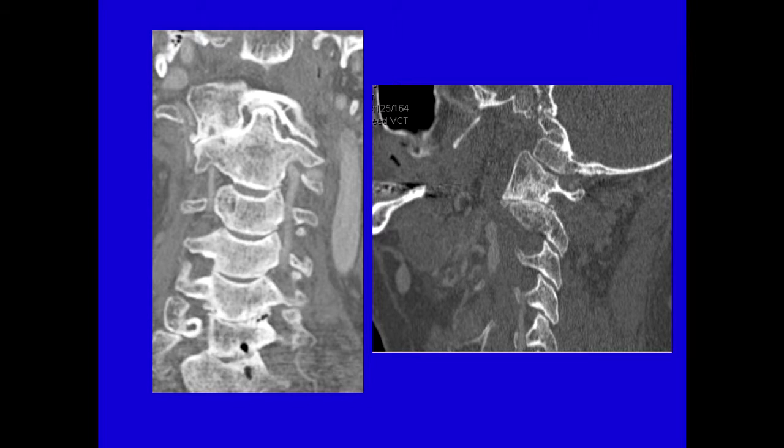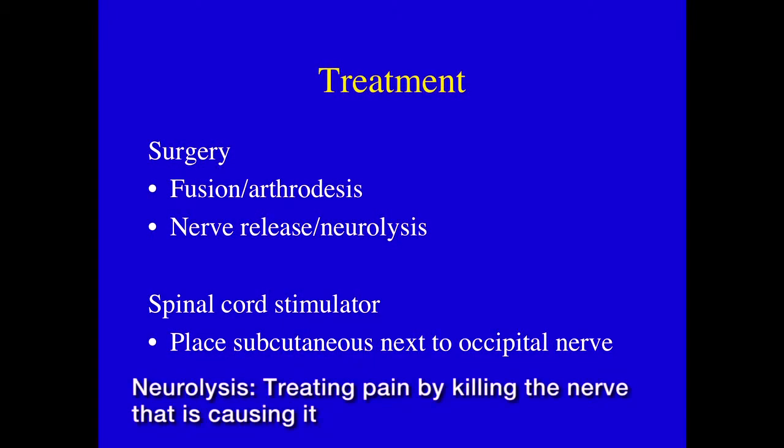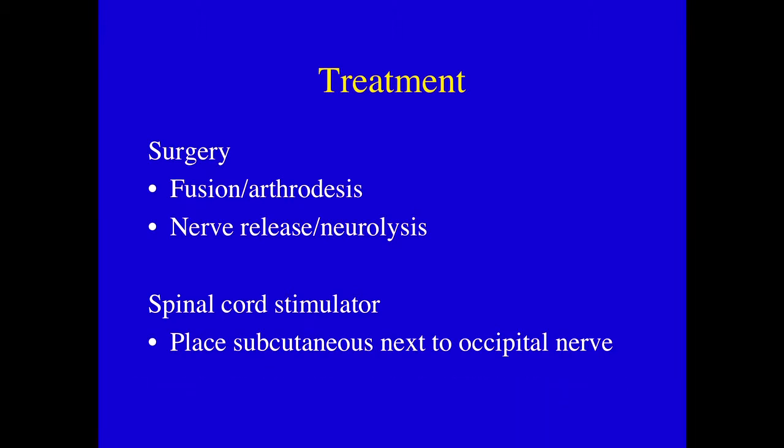So with CT guidance, we're able to access those areas and to inject for pain relief. Surgically, one can undergo arthrodesis or neurolysis, or you can also place spinal cord stimulators to try to help out with patients with cervical-related headache.